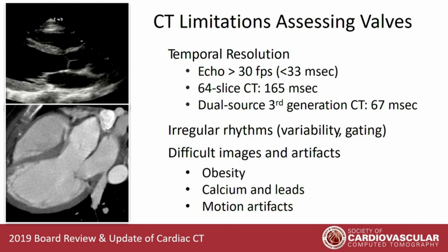Also, I personally love to smear and slander echo when it comes to artifacts and difficulty getting sonographic windows, but many of the same factors that can make echocardiography challenging can render cardiac CT challenging as well. Obesity, right? The bigger patients are, the more difficult it is to get the photon beam to penetrate all the way through the entire volume of the patient. Calcium is an issue. I would argue, and you'll hear me argue in the course of the next hour, that CT is in fact the best test. It's the diagnostic imaging test of choice for the evaluation of calcium. But dense calcification can be a problem for us in CT, and you've already seen examples of that so far.